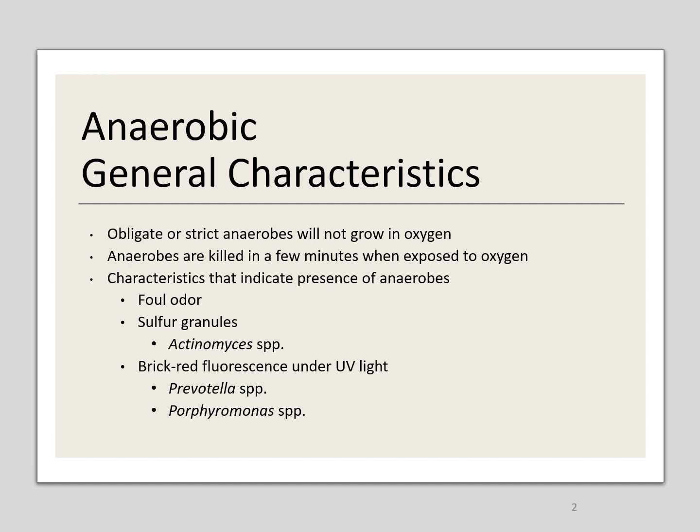If an anaerobic organism is suspected for an infection, then the presence of a foul odor or sulfur granules would give a good indication that it is an anaerobe causing the infection.